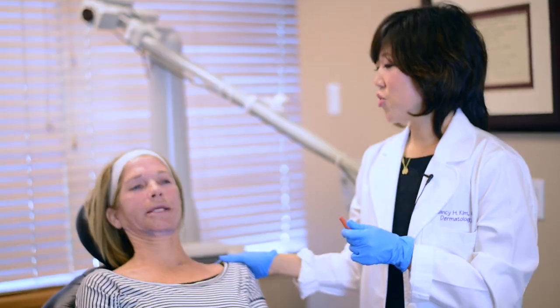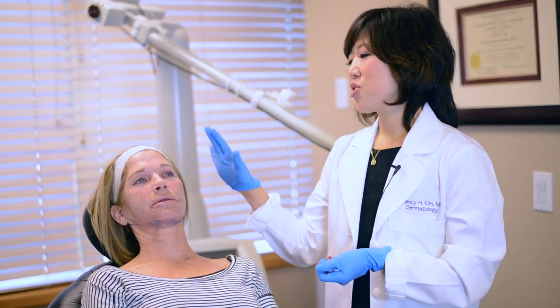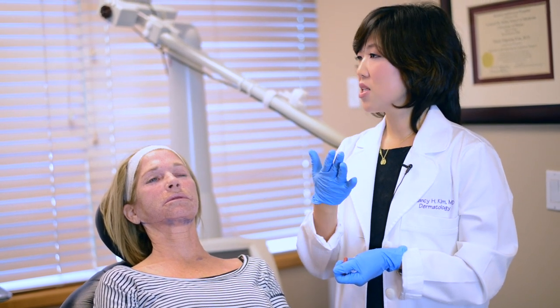By next week she'll come back and she's going to look beautiful. She can't smile because her face is so numb. But when she comes back next week she'll be very, very red, but she'll have an entire layer of new skin — kind of like baby skin. It's going to be much, much smoother and it's just going to get better and better.